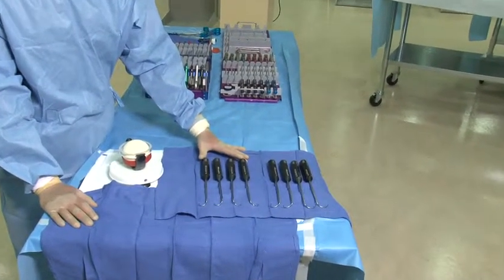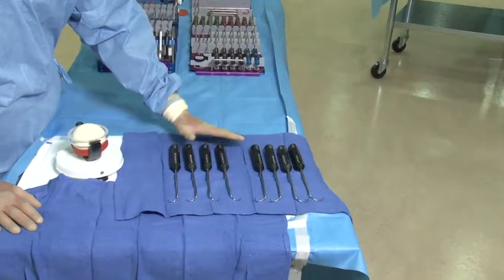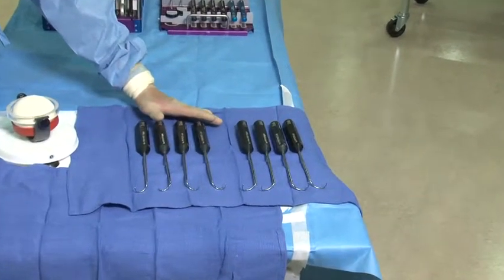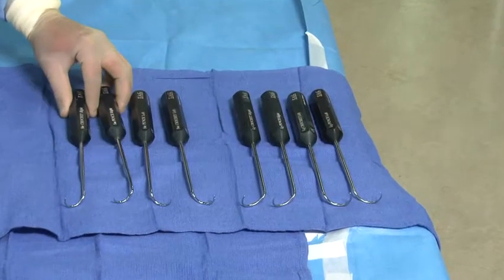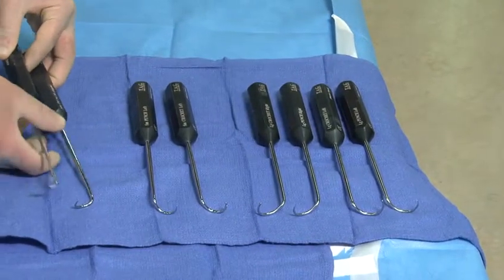Each hook is designed for right side and left side utilization and each hook is followed with a crochet type device to allow for passage of suture.